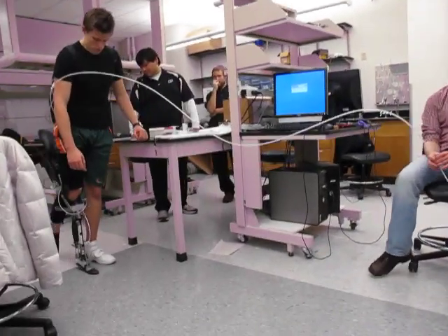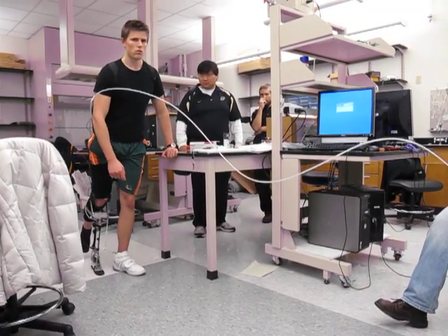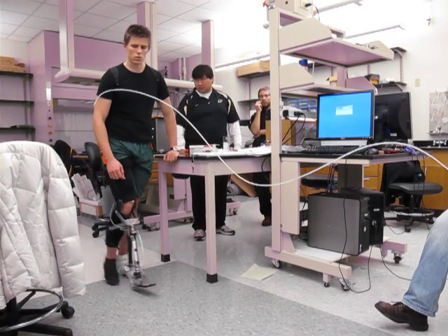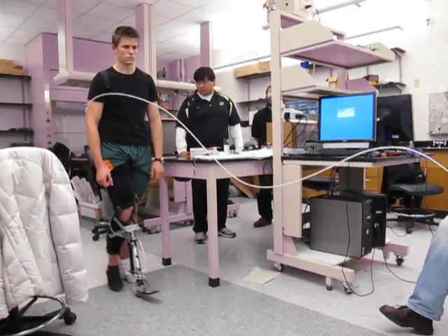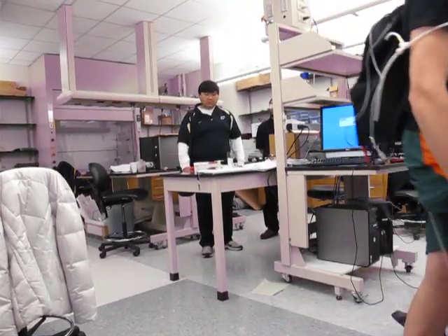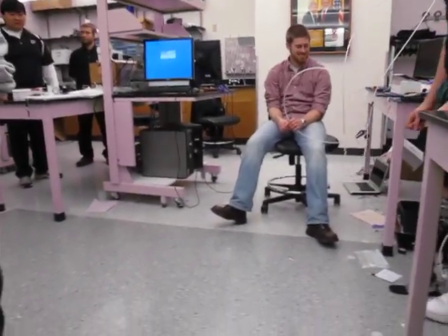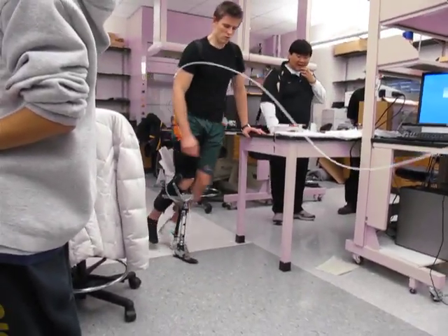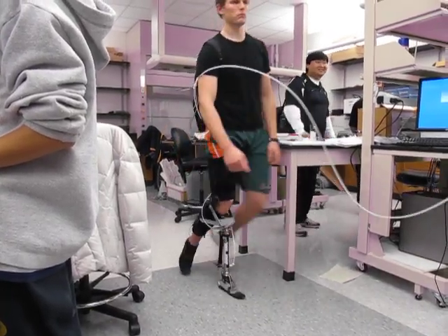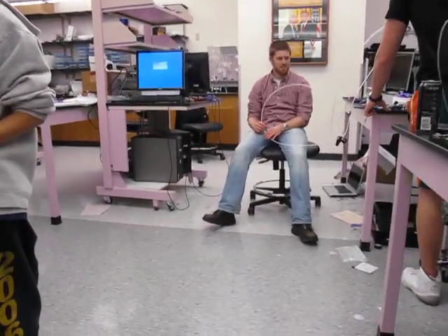How's it look? Are you still taping? Still going. It's just like your leg — you don't have to move your hip. You shouldn't have to, at least. We're in there. Now everybody's rooting for you. That looks like it could be a real prosthetic foot. Business walks tonight. Good job, you guys. That was just me stopping myself on my back foot.